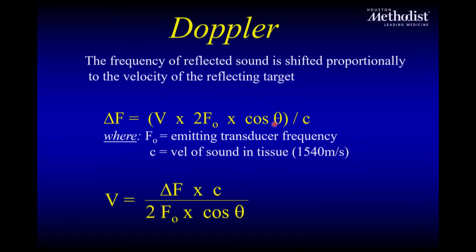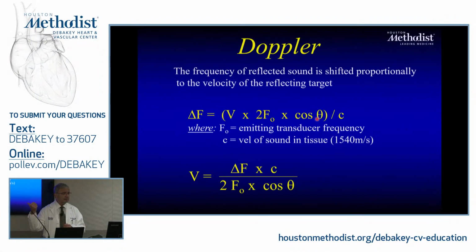An example is a very, very nice example that you could share with your friends. An ambulance is coming, or the train is coming. You can close your eyes and you could tell two things. You could tell whether the train is coming towards you or going away from you. And you could tell also how fast this train is going without you seeing it. That's basically the Doppler equation.